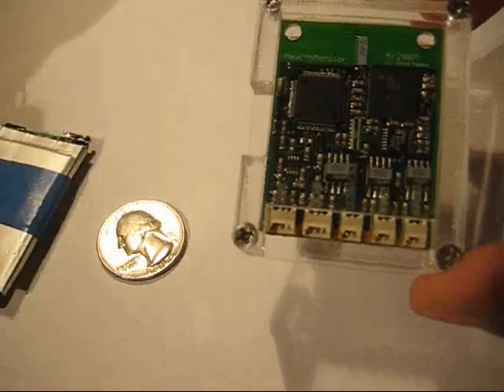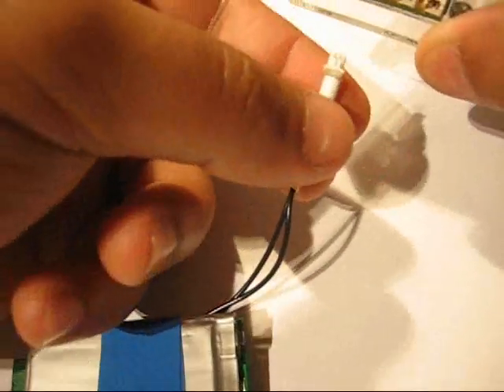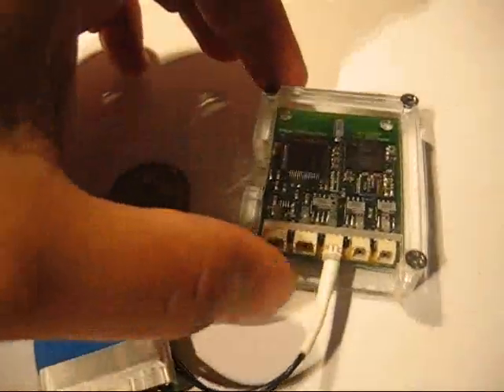Here is a brief demo of the operation of the health monitor. First, a small lithium polymer ion battery is connected. The battery has a voltage regulator taped to the back; however, this will be incorporated into the health monitor in the next version. This is all that's required to start the device recording data.